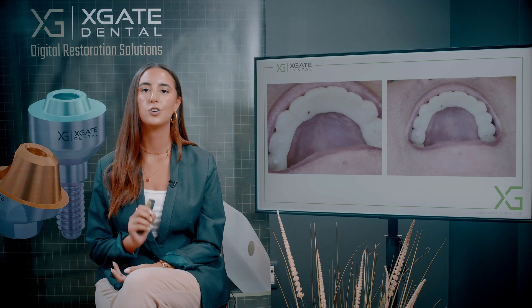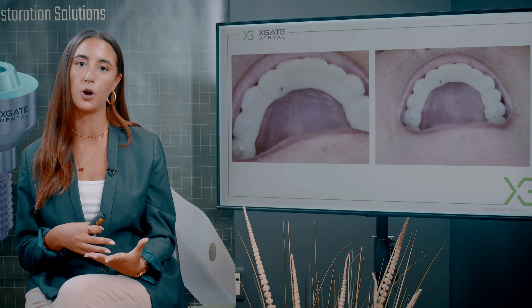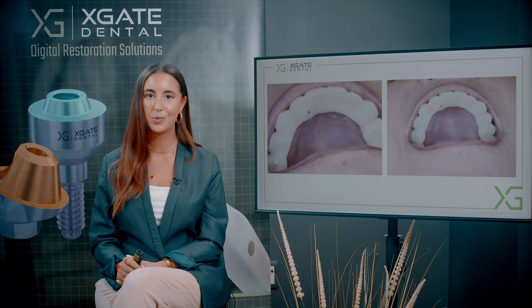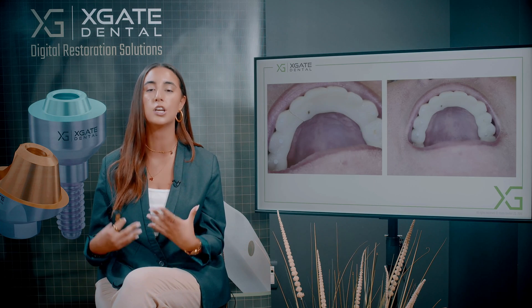Today we have a provisional bridge broken down. You can see the breakage point and we want to analyze why it broke down. We changed the prosthetic parts and fixed the issue of why it broke down in the first place. We'll also be able to take a look at how we analyze what we did in the process of changing the parts.